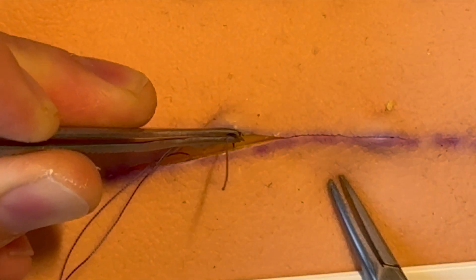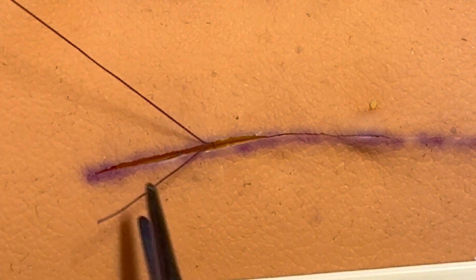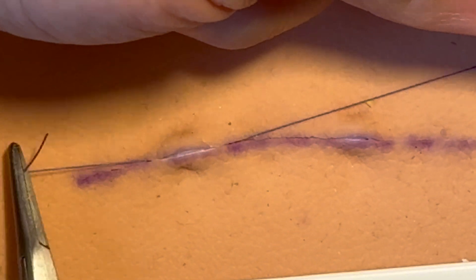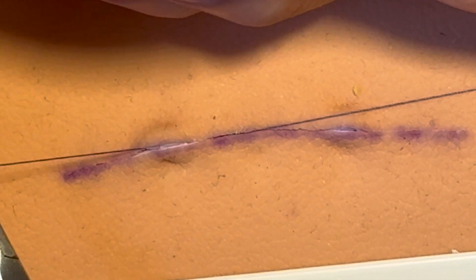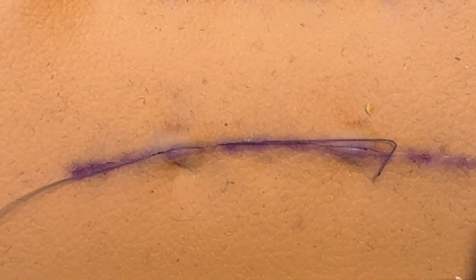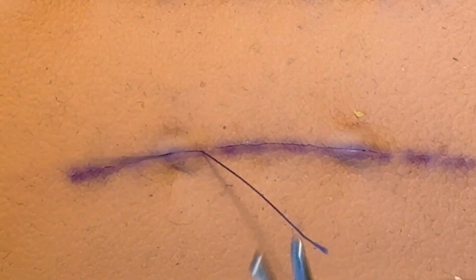Sorry about the shadows. Tie the normal surgeon's knot — grip it nice and tight. You can see how it's really pushing up when you tie it. There are various ways of tightening it — you can just turn it to lock it in position. Then do a second throw and a third throw and bed them down nicely.